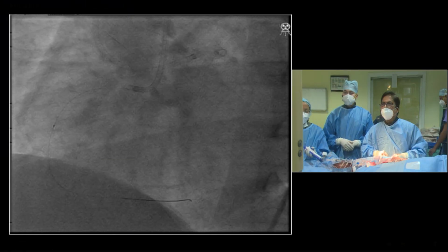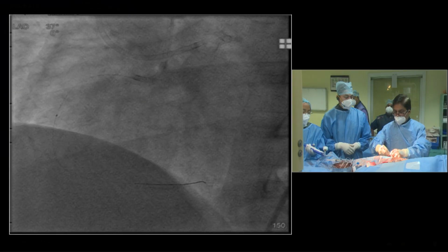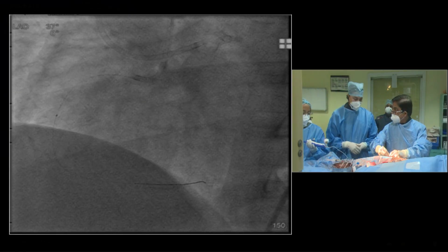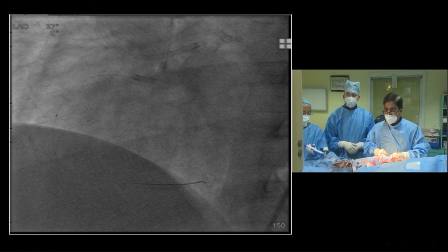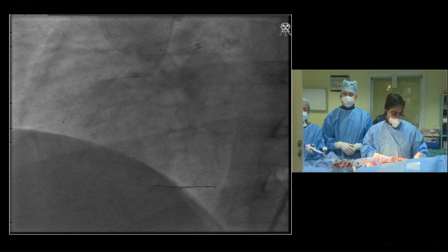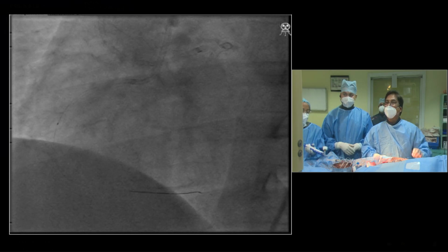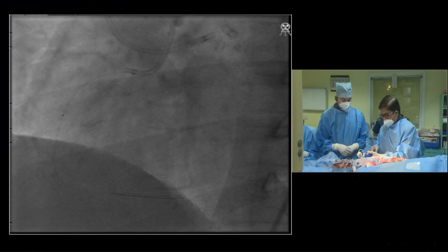I don't know why this image is not steady. You see how it is moving? I am not moving it. You see that? I am only standing like this. And it is moving. Then Goel sir, you stand 10 meters away, and let us see whether it will move automatically. He will tell all these things. Don't believe it, he is doing everything by his hand.